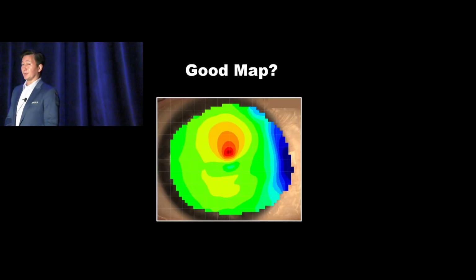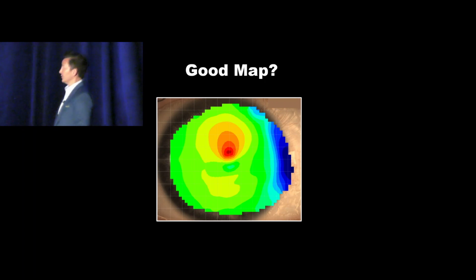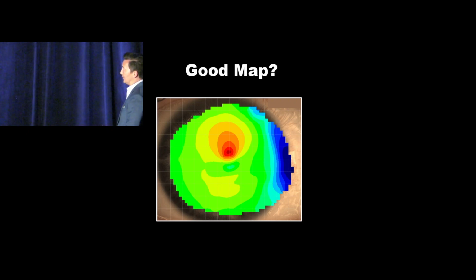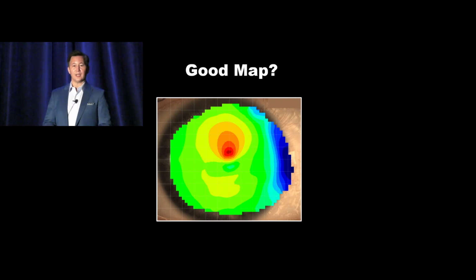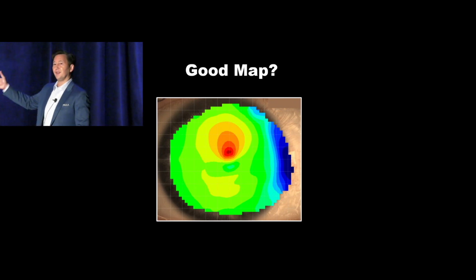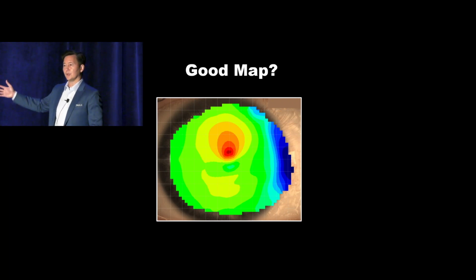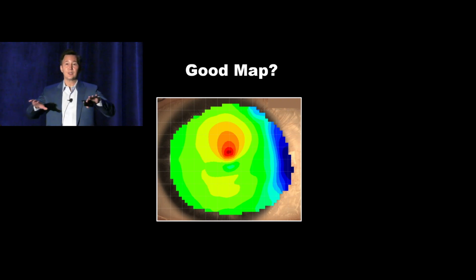What do you think of this capture? This is not a normal looking topography, right? It looks like superior keratoconus, and there's a channel right through the astigmatism of the eye, a flat spot. That's going to adversely affect the construction of the lens. What kind of fit do you think would result from us putting a lens on this bad topography? We think the eye has this central divot, this central hole, this flat spot.